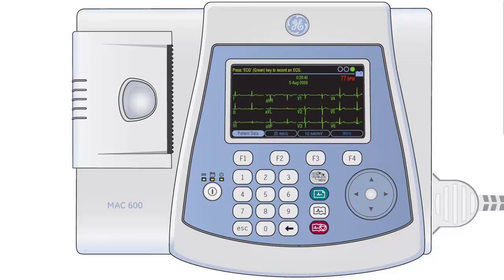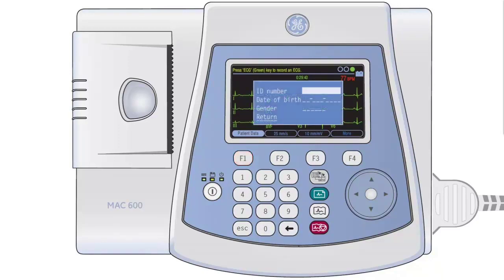You will now need to identify the patient. Press the F1 button located above the keypad. You will now be prompted to input basic information. Use the number and arrow pads to input the information and confirm each entry with the white circle in the middle of the arrow pad. A minimum of the patient ID is required. When working with System 1, the patient ID is the patient's NHS number. Once you have input the patient information, ensure you have Return highlighted and press the white circle in the middle of the arrow pad.